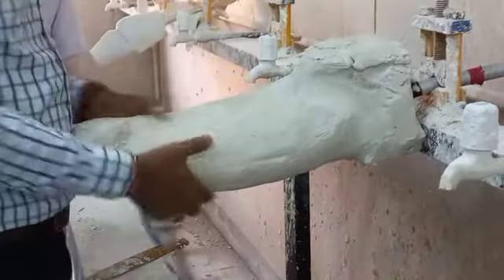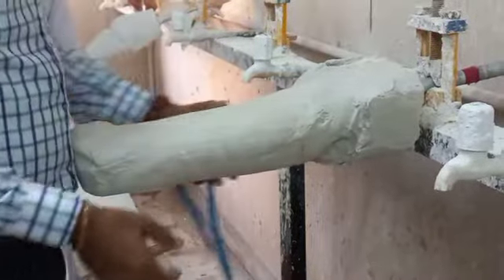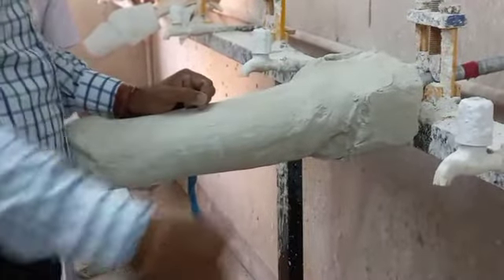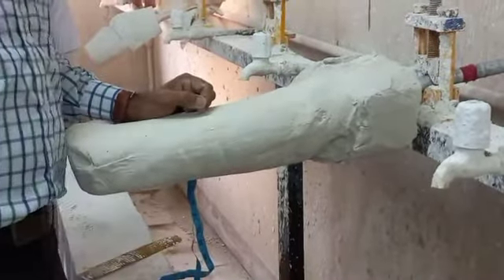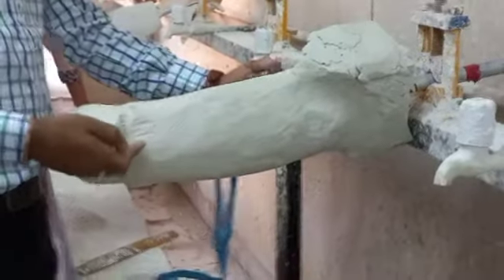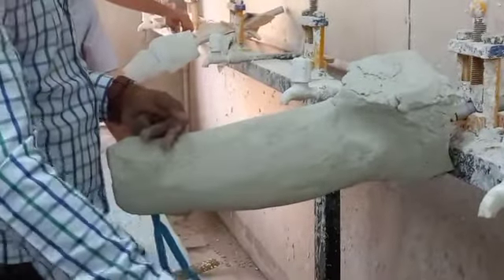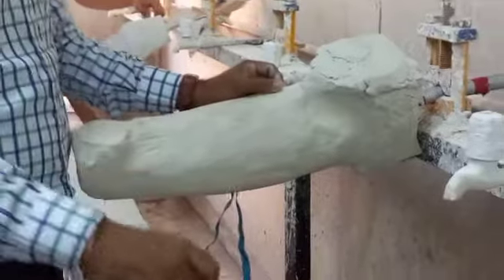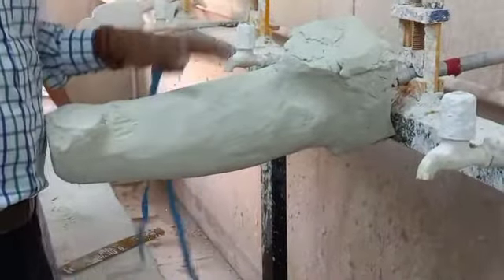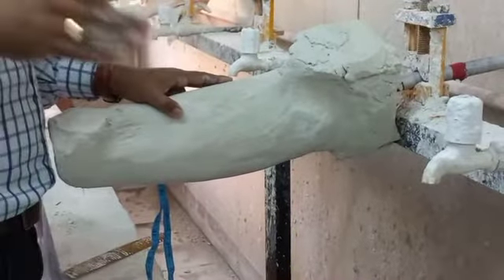So we will know, whatever the measurement of the patient, that is already noted, right? What is the measurement of the patient, that is already noted at a particular level, let's say the lowest point of the IT. From there, at equal distances down, we had taken measurements. Those measurements are already there, and at the same point now you have to write down the correct measurement of the positive mold without any modification. These are the important precautions that we will be taking care of.